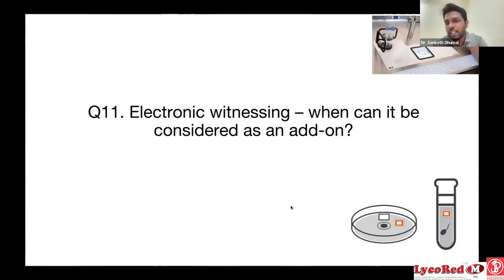Not that way. See, it is like this. Personally, I am not a big fan of this witnessing, but still, how it helps is what I'm going to say now. Because this alignment of tags is very important, the initial step.